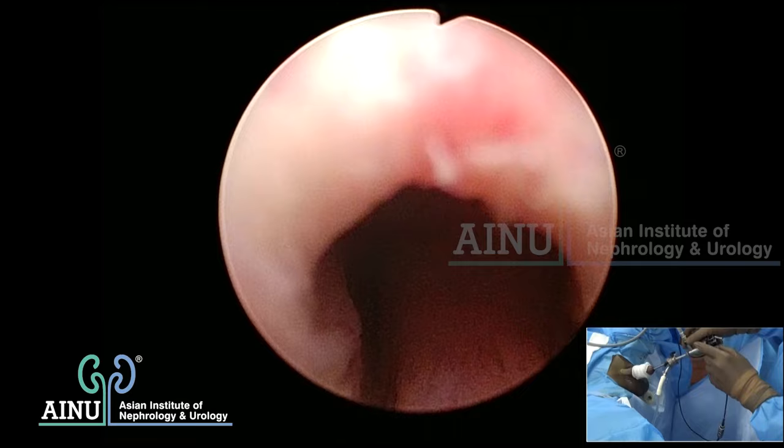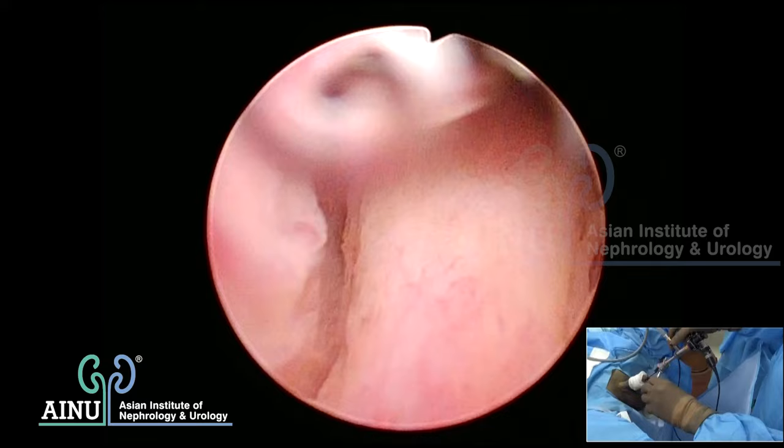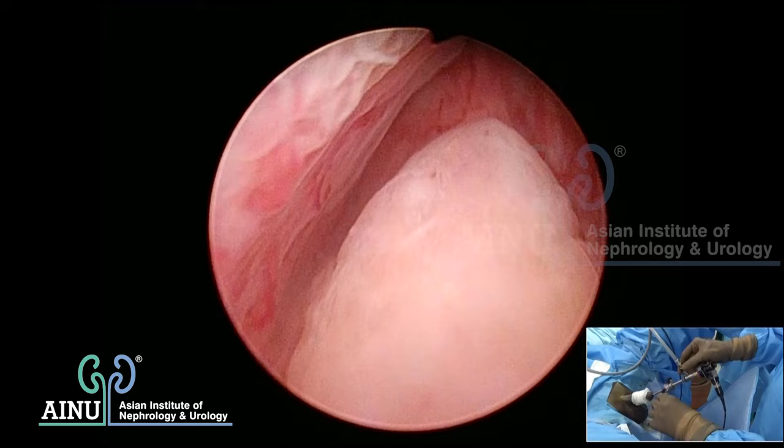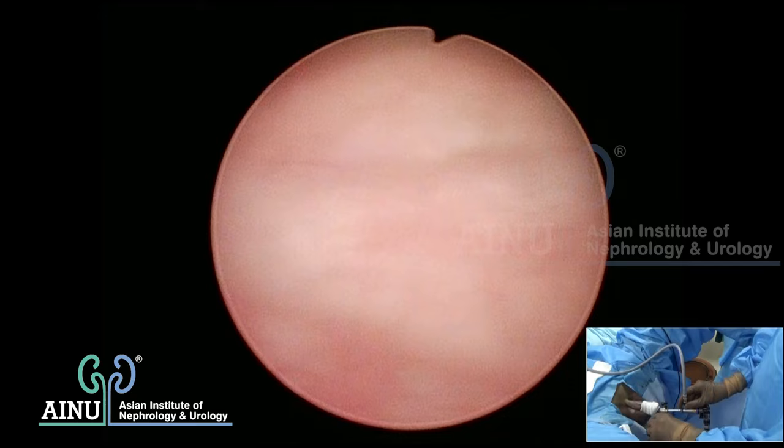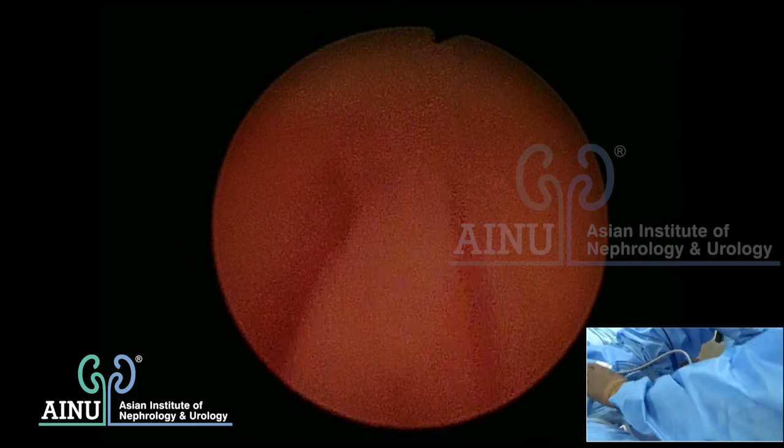You can identify the sphincteric area by a groove and ring-like appearance. There's some gland extending just beyond the verumontanum. Assessment of the prostate is done. The bladder shows a little trabeculated appearance, and assessment of the rest of the bladder is needed to rule out any tumor or other pathology - it appears normal.